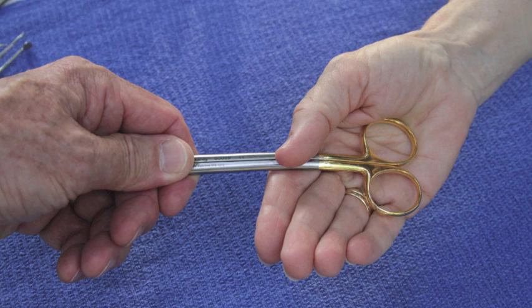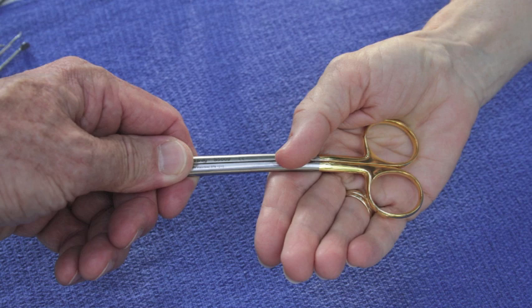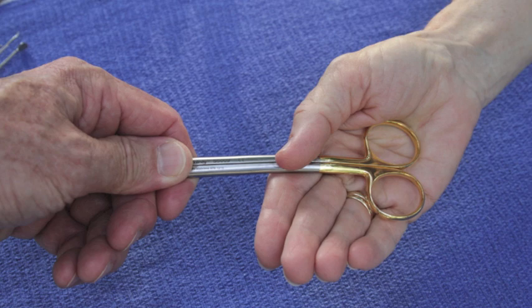The assistant will then hold the instrument where it is until such time that they can see that the thumb has pushed down on top of the instrument, thus grasping it. At this time, the assistant is free to let go.